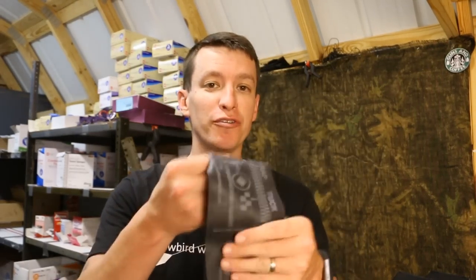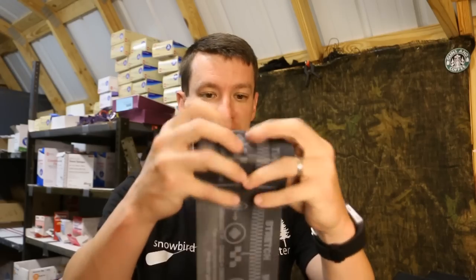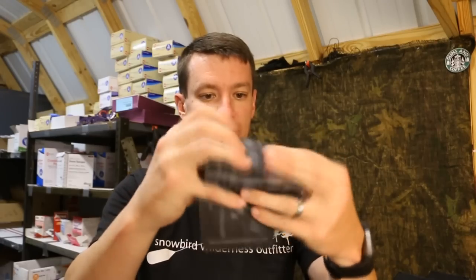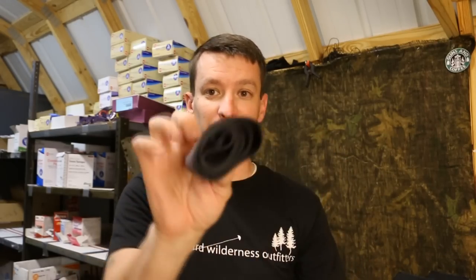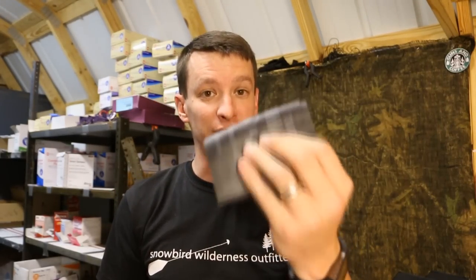The other great thing about the SWAT-T tourniquet is how flat it folds. This would make a great everyday carry tourniquet because you can roll it up and it fits in your pocket very easily — it lays flat. You can even roll up some combat gauze with it, put it in your pocket, and it's a great EDC tourniquet.